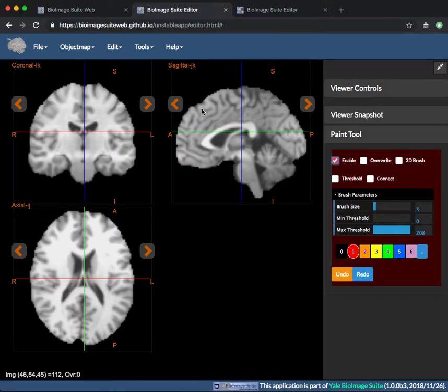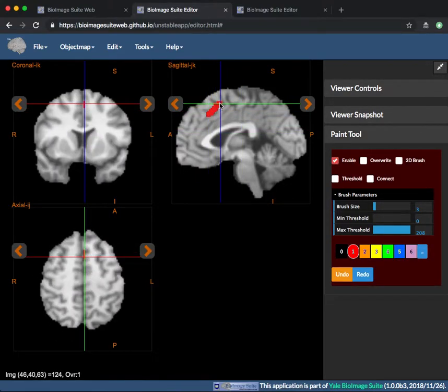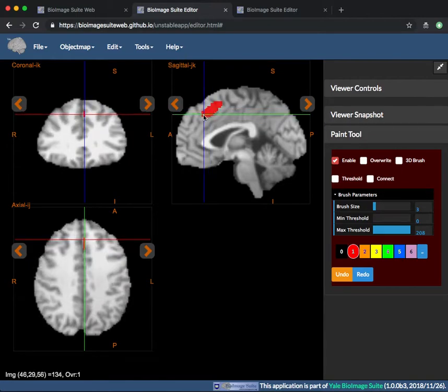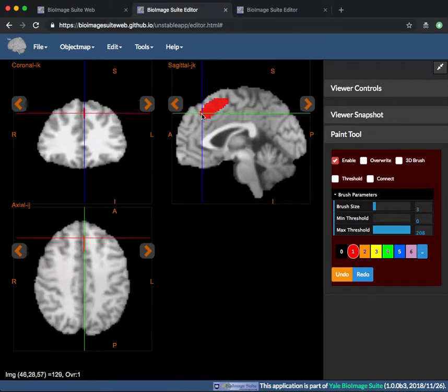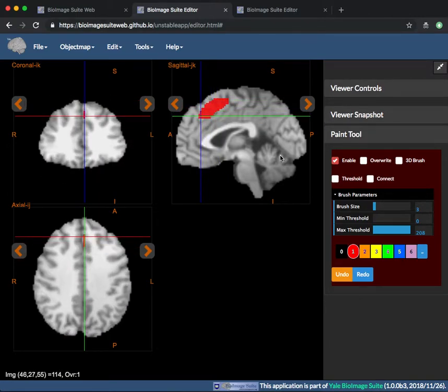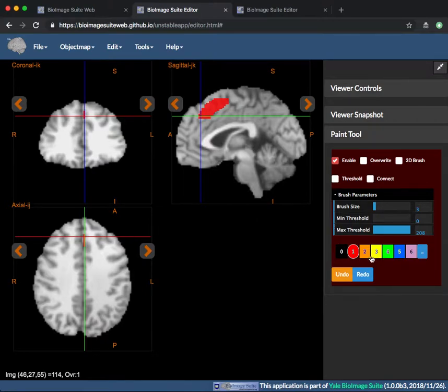First is enable. If this is checked, the Paint Tool will receive mouse input and use it to paint over an image, thus creating or editing the object map. If this is on, the Paint Tool will be highlighted with the red background color.